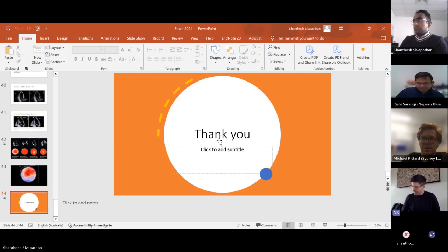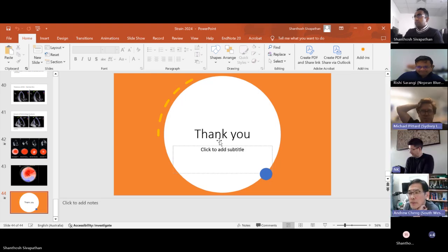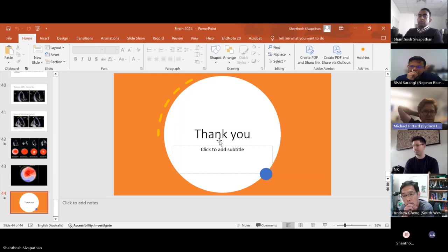No, thank you very much. Shanthosh, obviously it's so dependent on the imaging quality, and I know you've been doing lots of echoes in ICU the last 12 plus months. How often are you actually able to get images that are good enough that you can do strain that you think is actually accurate? I'm not asking for an exact number, but like.